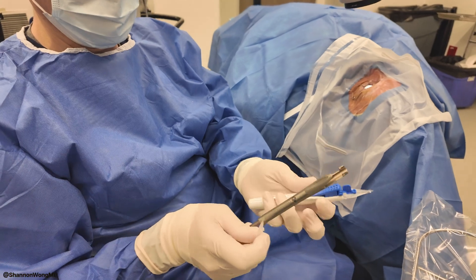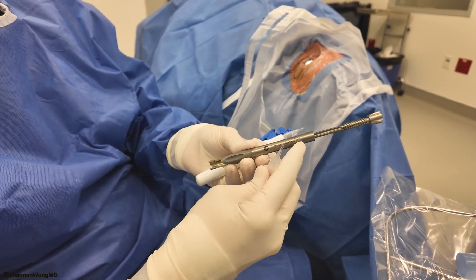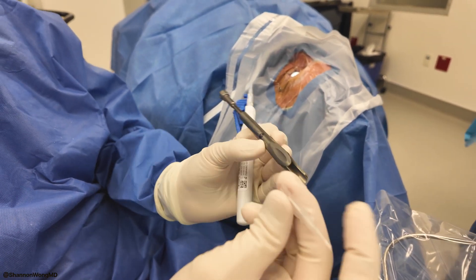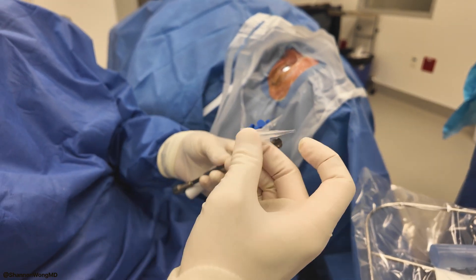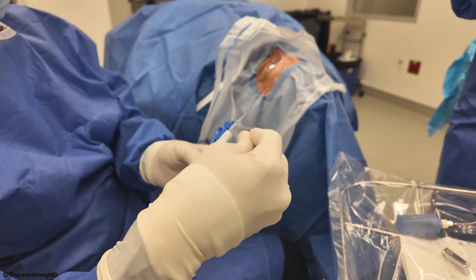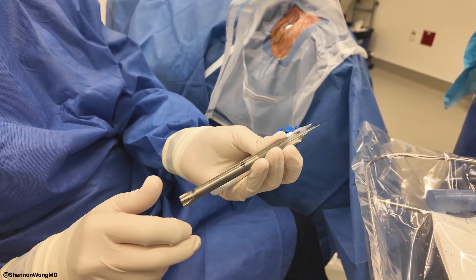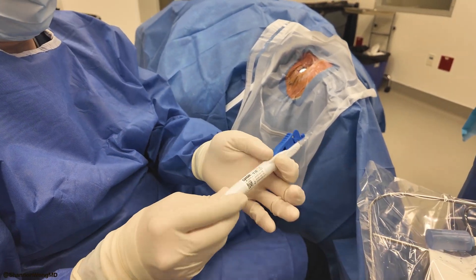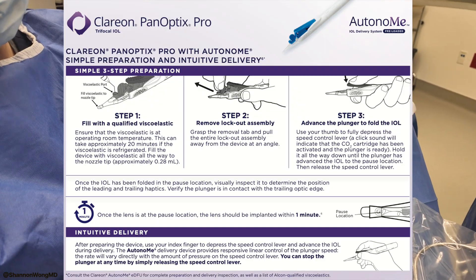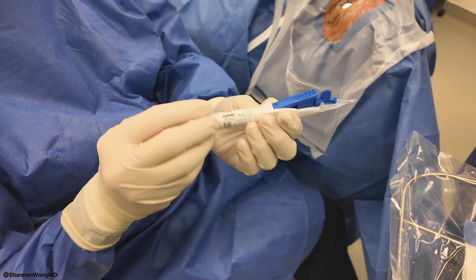Let's look at this side by side. This is the normal Clarion Monarch 4 injector with a little cartridge. And normally I would put the lens in this guy, place it in here, and inject the lens. Pretty simple. But for reasons that are unclear to me, Alcon has engineered an Autonomy injector system. This has CO2 in this area.